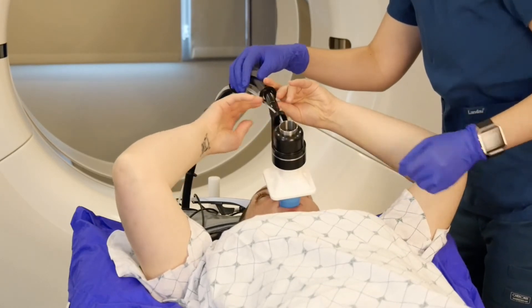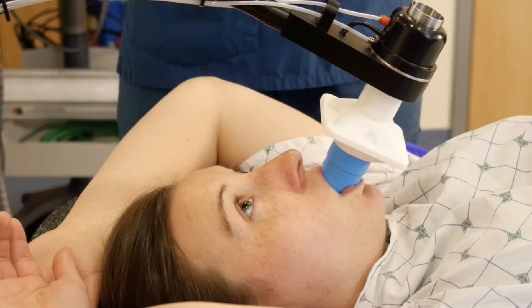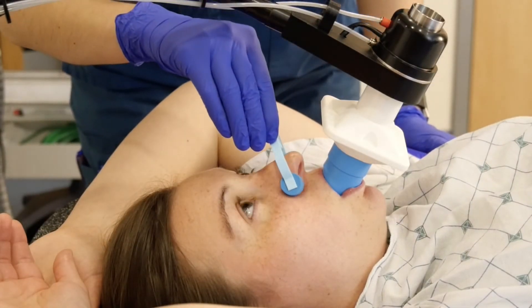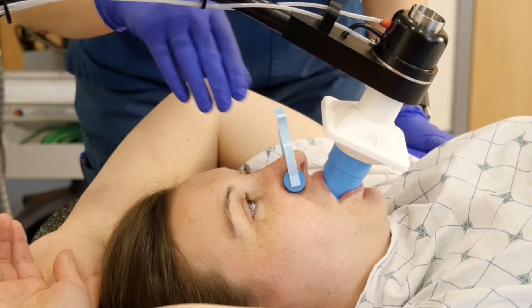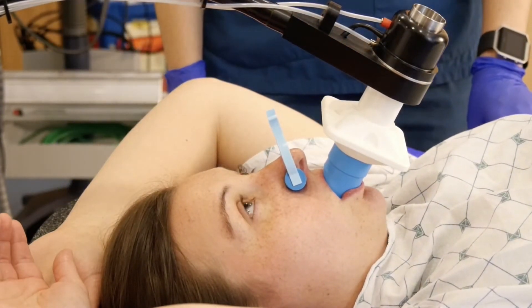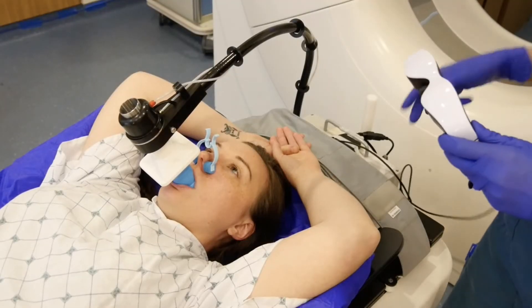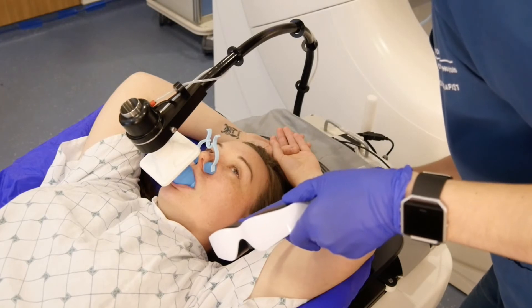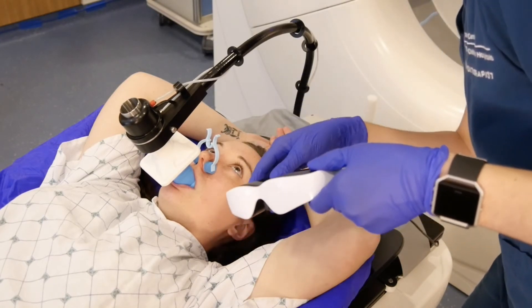Both the mouthpiece and the bacterial filter are changed daily. The therapist will ask you to place a nose clip on your nose to assure that you only breathe through your mouth. This allows the system to properly track the volume of air in your lungs. Next, the therapist will give you a set of video goggles which will allow you to see the visual cues that show when you should hold your breath.